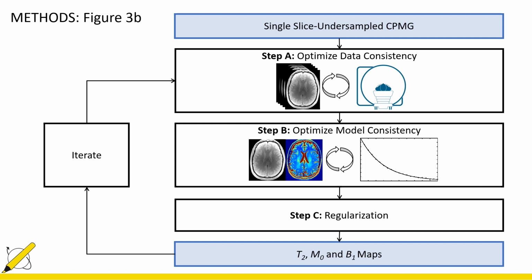But we used our own model-based reconstruction that is basically capable of also incorporating a numerical signal model. We use the extended phase graph simulation, EPG, to also account for stimulated echoes and get ideally more accurate T2 values than just using a mono-exponential decay.